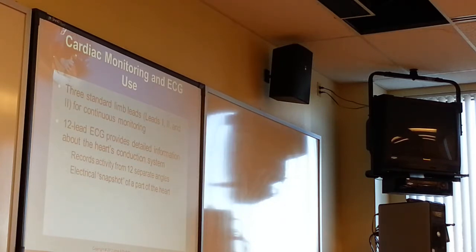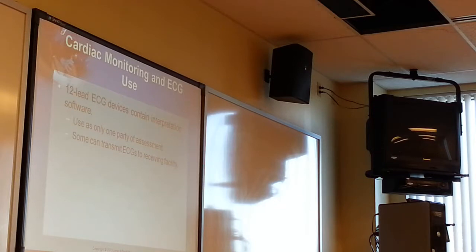We didn't have them back then. When Sherry and I started, there were the LifePak 10s. We didn't have the 12 leads, and now they're starting them. We talked about this. The 12-lead EKG is an interpretation that the monitor is giving you, not you looking at it. Okay, it's very easy to transmit now.